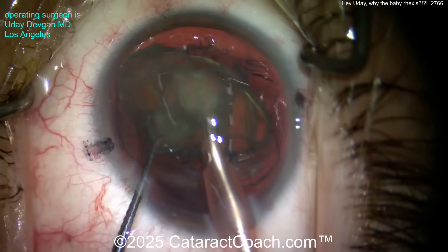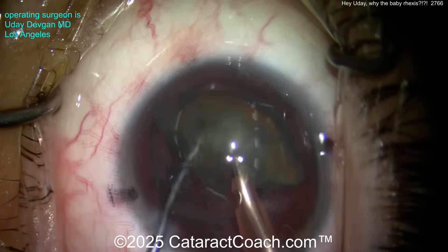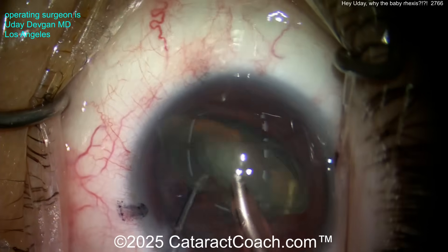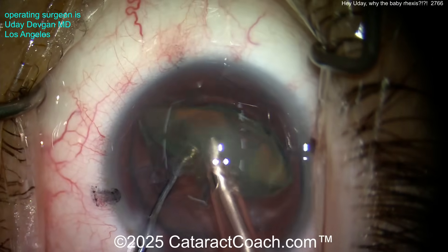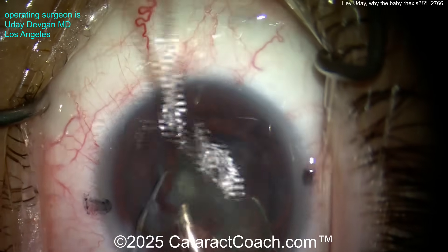The cornea is unusually flat, somewhere in the mid-to-high 30 diopter range. We're going to take this nucleus out bit by bit. The goal here is control — I don't care what the time is, I'm not here to race the clock. I'm here to give a beautiful outcome. It's why we spent so much time measuring that rhexis: make it pretty, and now take out that nucleus.